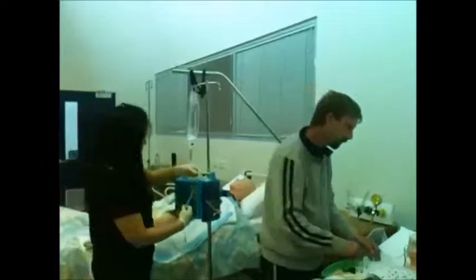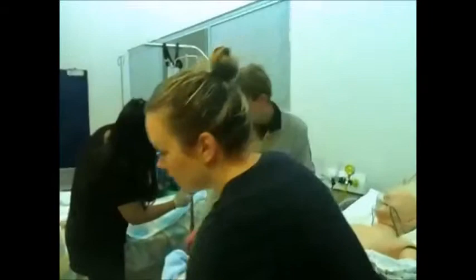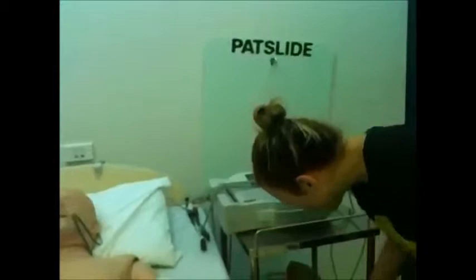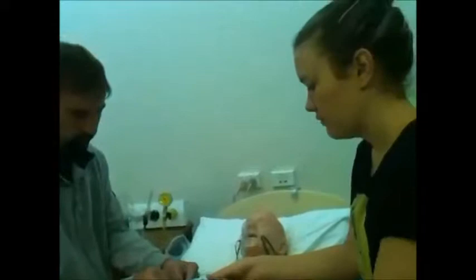Okay, we're just going to do an ECG. You had one of those this morning. I'm just going to draw it down a little bit — just let it not get too cold. So as I said, you're not going to feel anything, there's no pain. You just need to make sure you stay really still when we actually start it up. I'm just going to set up now. Make sure there's no bubbles. Excellent. And then just see the side of the leg as well. It's all good.